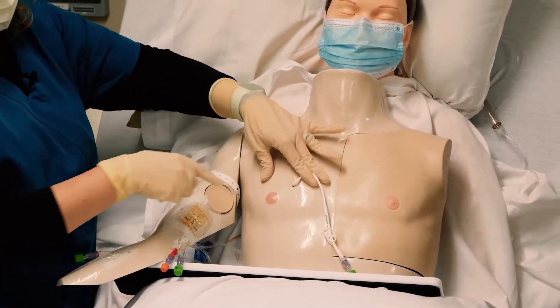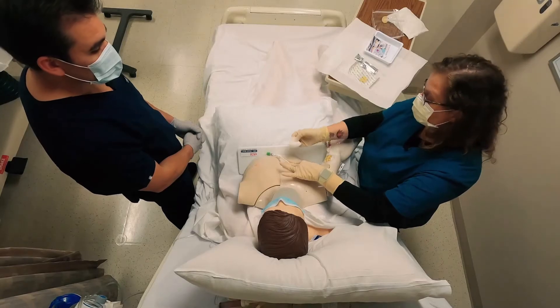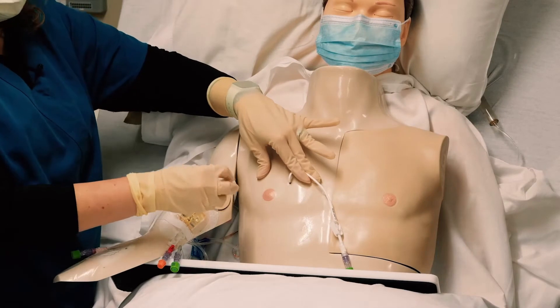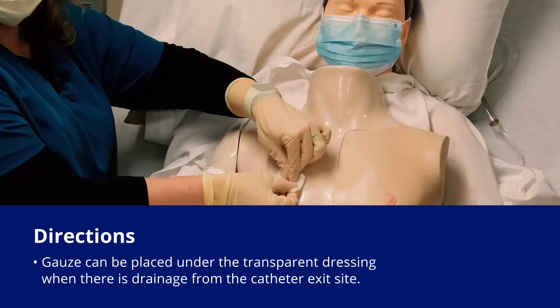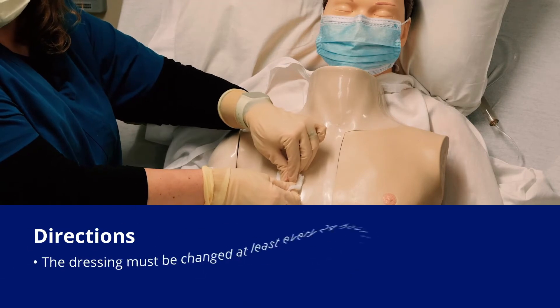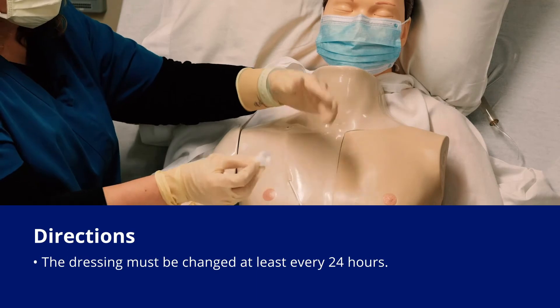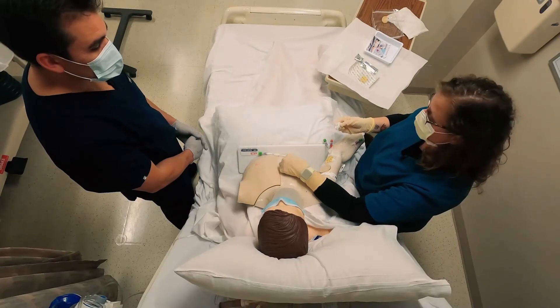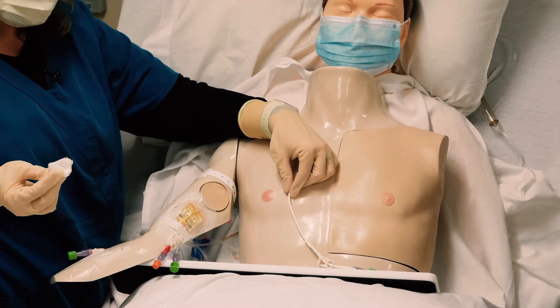If there's crust on the catheter — and sometimes there is — you can use an alcohol swab or the gauze for that. If your patient has drainage at the site, you might use gauze over it, but if you use gauze over your central line you then have to change the dressing every 24 hours. I used the gauze just to dry off the skin here because he's a mannequin.